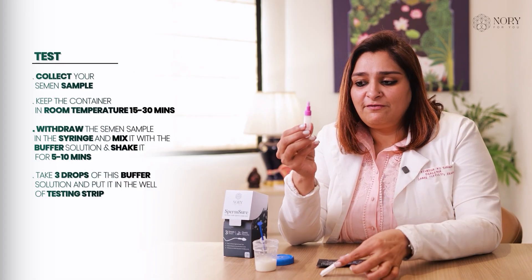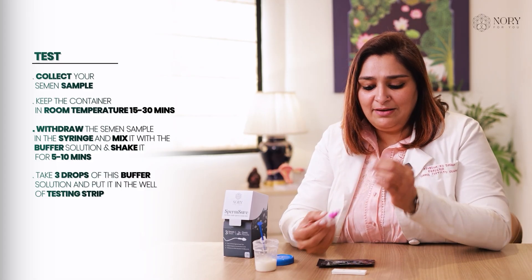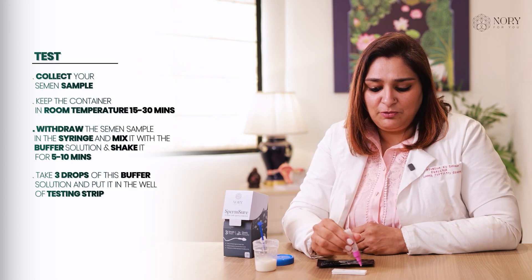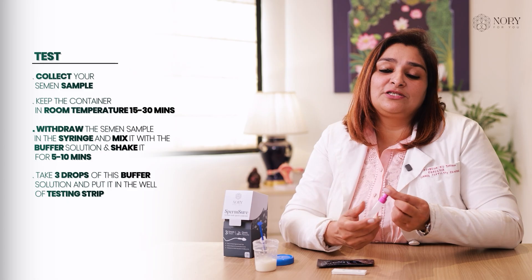After a while, take 3 drops of this buffer solution and put it in the well, just like we do in a pregnancy test. Put 3 drops in the well and wait for the result to come.